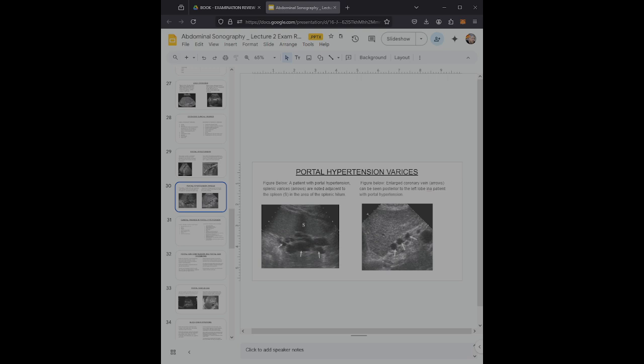And this all increases the patient's likelihood of developing portal vein thrombosis. So essentially, patients with portal hypertension will have many of the same sonographic findings as cirrhosis, including ascites and splenomegaly, with the addition of a portal vascular and shunting abnormality with this development of collateral channels.